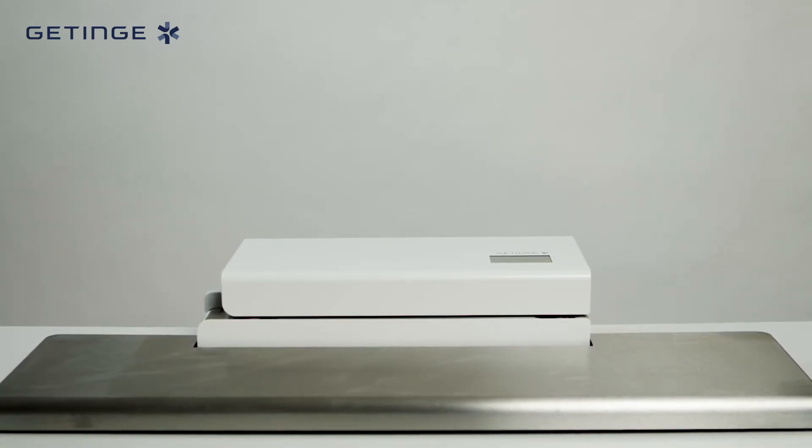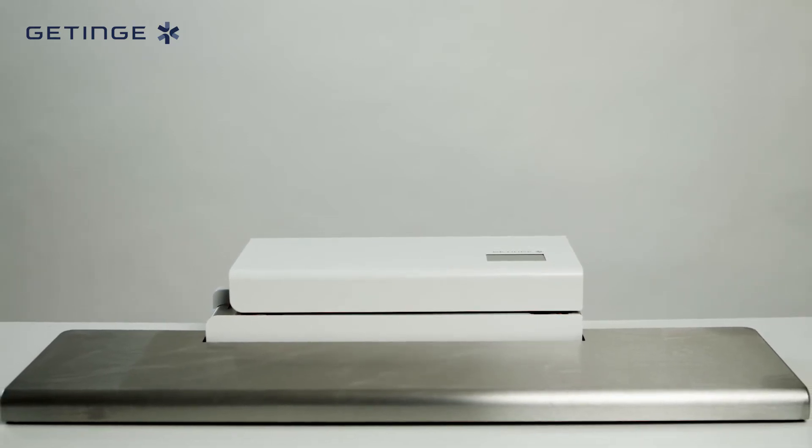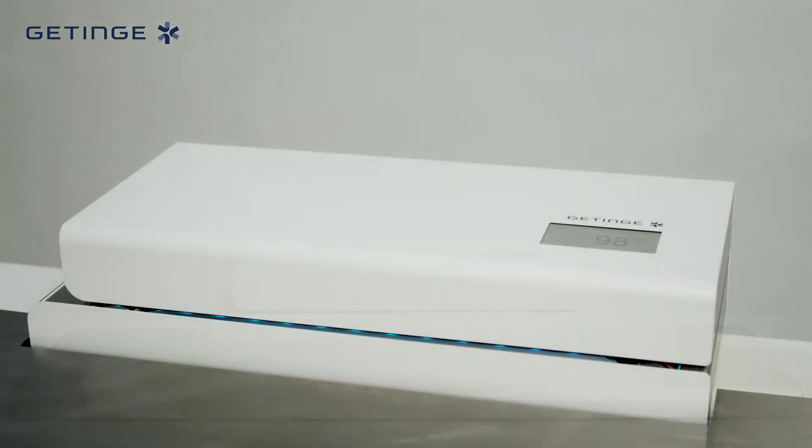Getinge ProSeal Plus and Premium Rotary sealers are designed for high-volume operations without sacrificing user-friendliness. The Premium model is equipped with three different blue light indicators for easy identification of the sealer status, even from a distance.